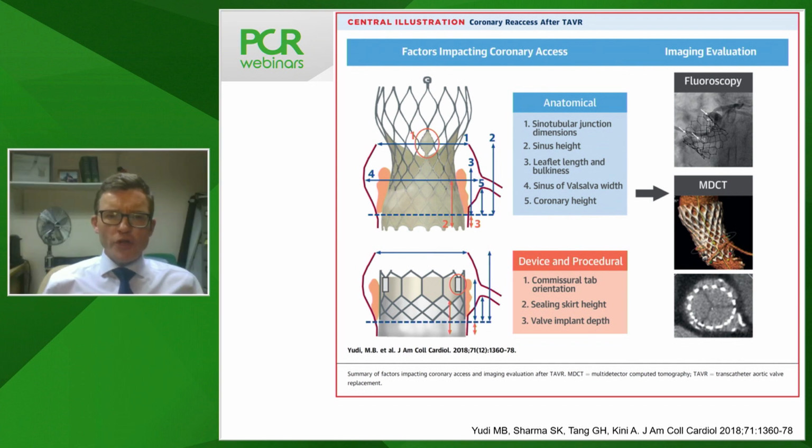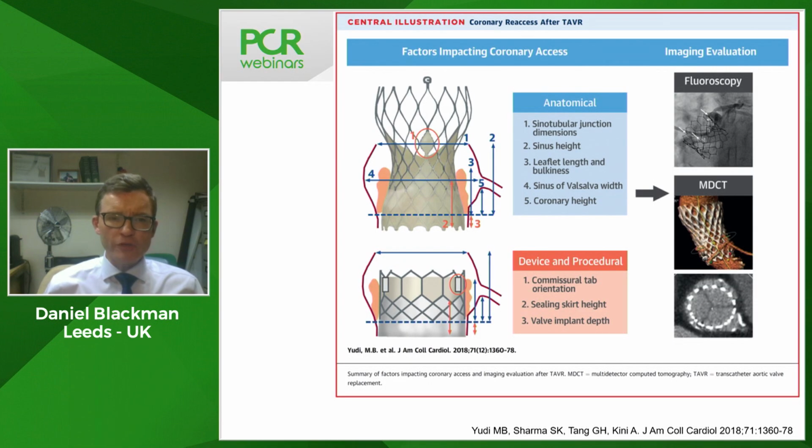Yeah, it's a good question, Sonia. I think, certainly at the time of this patient's presentation, and particularly faced with a patient where there'd already been a failure for selective coronary cannulation, that might have pushed me towards a femoral approach, because although I perform almost all of my angioplasty from a radial approach, it can be more challenging to access the coronary arteries from the radial. So there's some advantage to femoral, but I must say now I'm so much more comfortable with radial that I would still go radial.